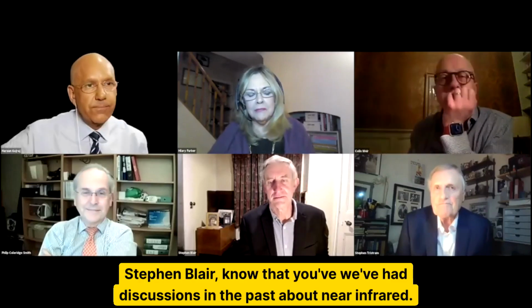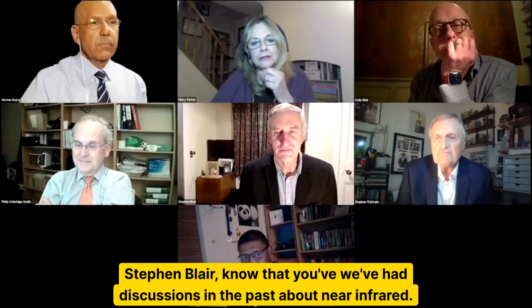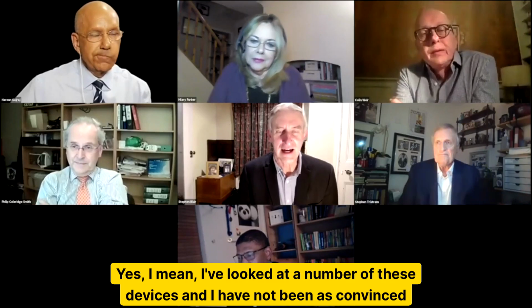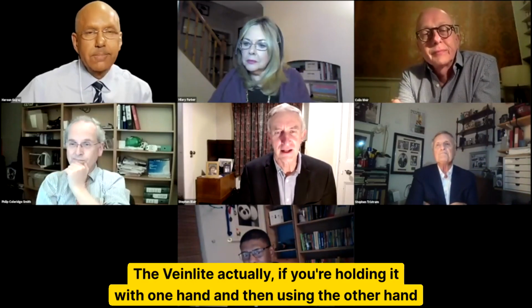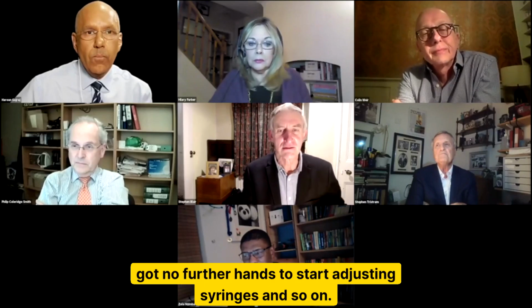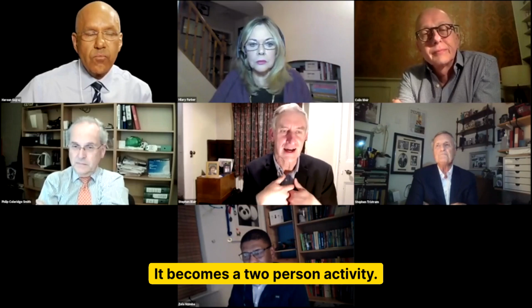Very good. Questions for Haroon. Stephen Blair, I know that we've had discussions in the past about near infrared, so I thought you might have a question for Haroon. Yes, I've looked at a number of these devices, and I have to say I've not been as convinced about a number. The VeinLite, actually, if you're holding it with one hand and then using the other hand to cannulate, you've got no further hand to start adjusting syringes and so on, and it becomes a two-person activity.